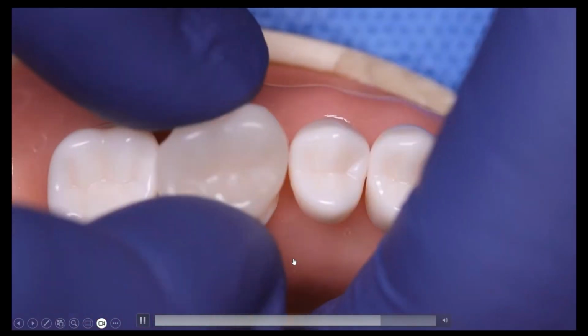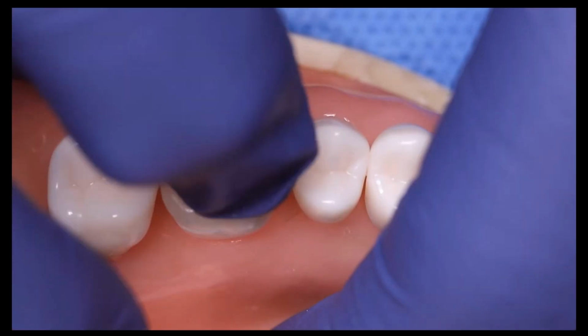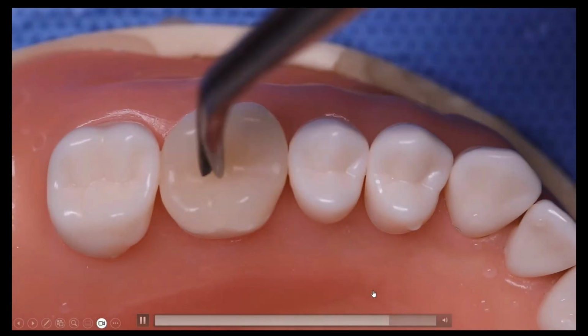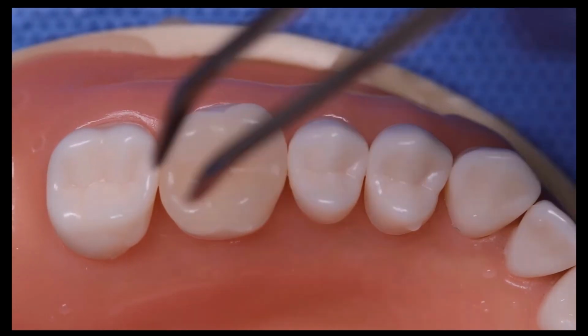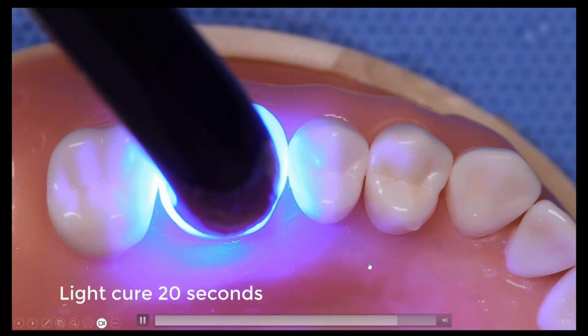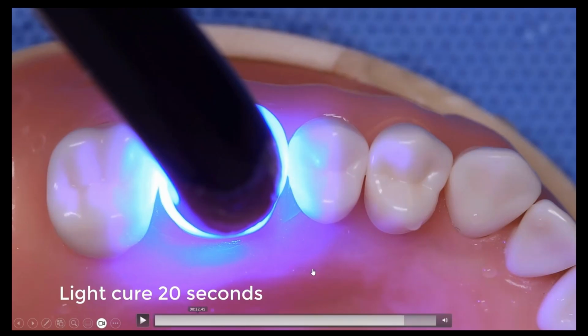Take my temporary, and I'm going to seat it down, and I'm going to cure. Okay, I'm going to cure for 10 seconds each surface. Now, normally you hold this down, by the way, and you all know that. Okay, so I'm going to light cure this. So I did 20 seconds on there, and I did 10 and 10. And then I'm going to clean off the excess. The excess usually is a liquid Vaseline.